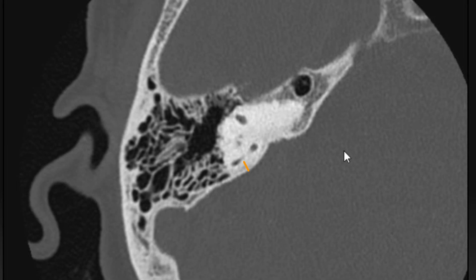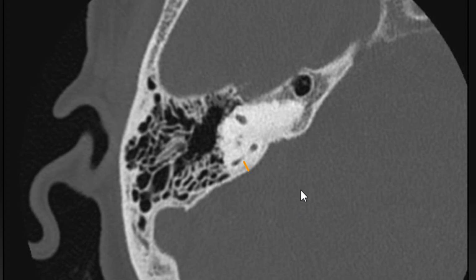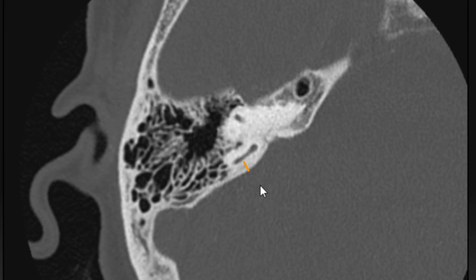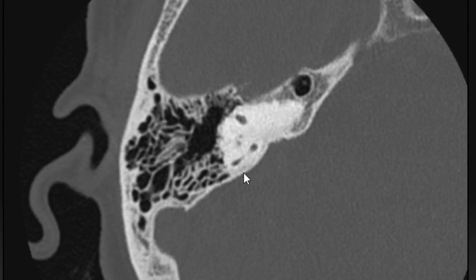And our paper showed that anytime it's below 1.2 millimeters, that's thin. And you can see a fetal orientation vestibular aqueduct in that scenario and hypoplastic sac. Whereas if it's thicker than 1.2, it's almost impossible for that patient to have an endolymphatic sac hypoplasia. So rather than doing all this measurement, the easier way is just to look at this retrolabyrinthine bone thickness. So we published on that.